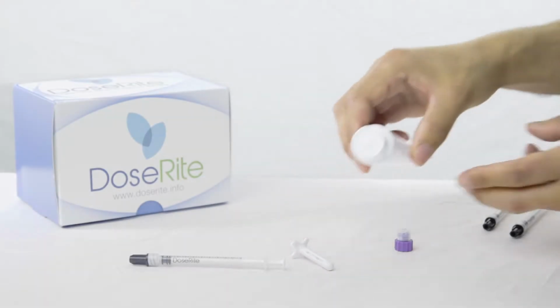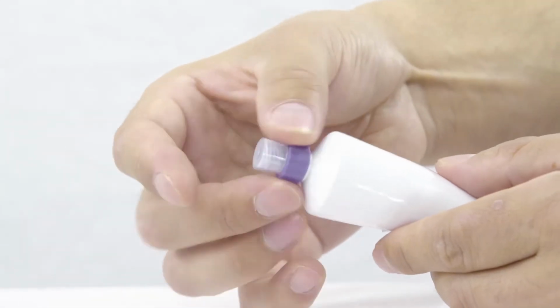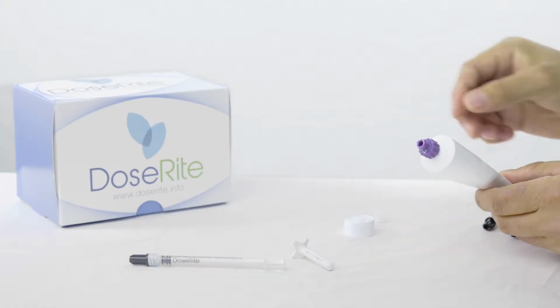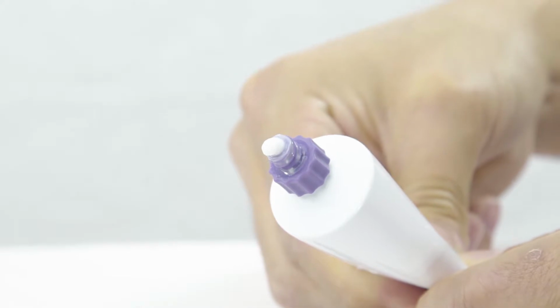Remove the cap from the tube and replace with adapter. Attach adapter until tight. Then remove the cap from the adapter. Prime the tube by squeezing until medication appears inside the adapter.